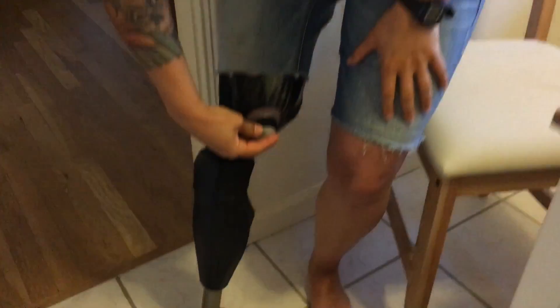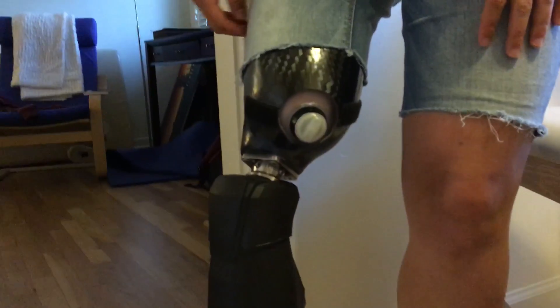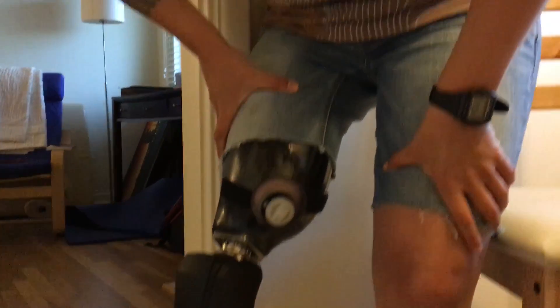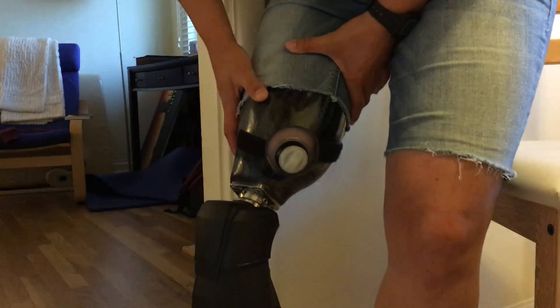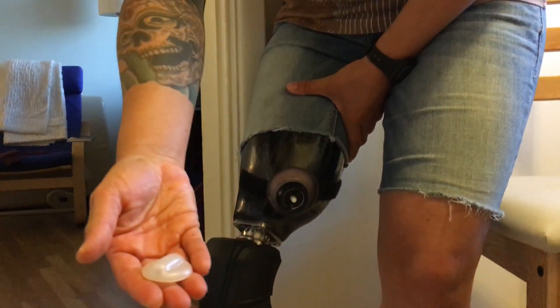It's just a little cap, and it fits perfectly over the valve, so there's no way anything's happening. And then you can put a strap over it to just keep it on nice and snug. Okay, that's it — a little cap.